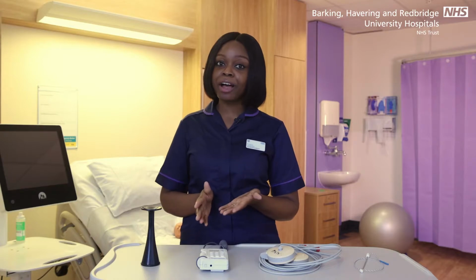During labour, various assessments are made to ensure labour is progressing normally and your baby is not experiencing any difficulties. One such assessment is listening to the baby's heartbeat. Most babies go through labour and are born without any problems. But there are a few babies who have difficulties, and the best way of finding out when a baby is having any difficulty is to listen to their heartbeat regularly during labour.